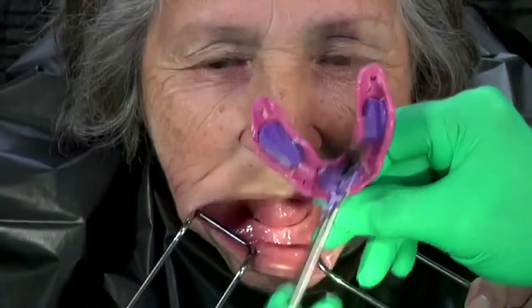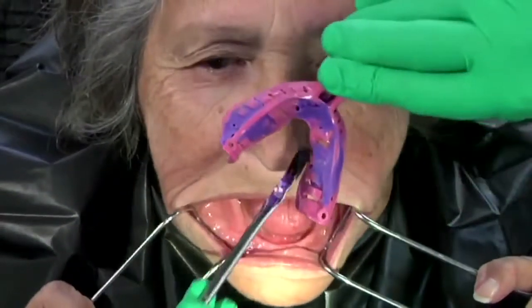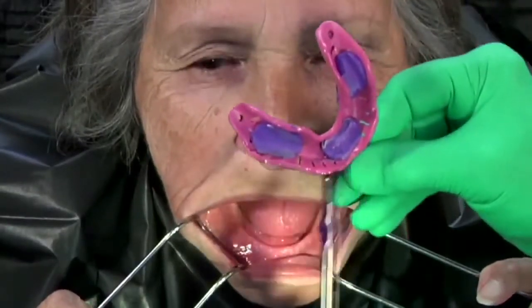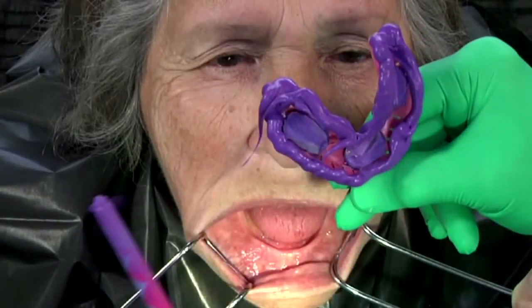Now, place adhesive on the peripheral portion of the tray. Inject rigid viscosity polyvinyl siloxane onto the peripheral areas of the tray. Make certain to apply adequate amounts on both the labial, buccal, and lingual surfaces of the tray.